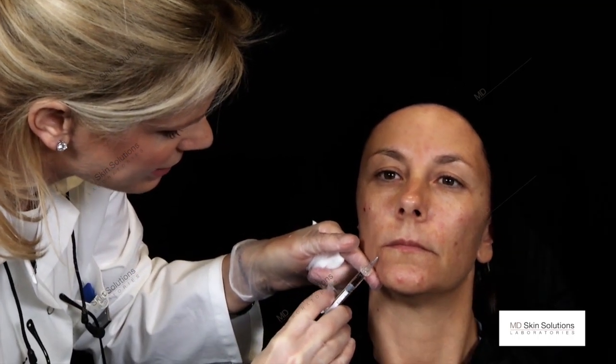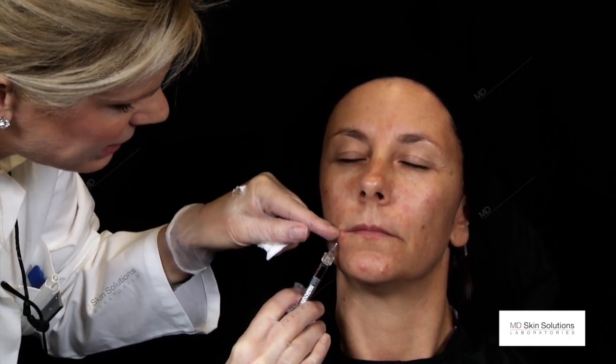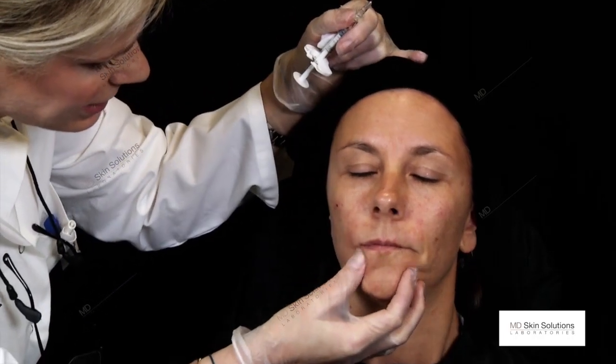It's again the 27 gauge needle, 45 degree, and then we lift up, and the needle sits at the red-white border of the lip, and we inject in a retrograde fashion. And place the filler in the subdermal level.